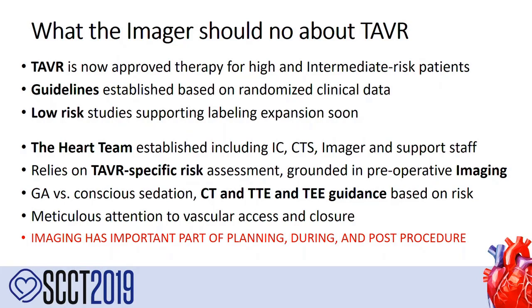So TAVR is now approved therapy for high and intermediate risk patients. It is in the guidelines and has been established based on randomized clinical data, and low-risk studies supporting labeling expansion, and that's probably going to come soon, I believe, in the fall. What TAVR did is really establish the heart team, which includes interventional cardiologists, cardiac thoracic surgeons, imagers, and support staff. And it relies on TAVR-specific risk assessment, which is grounded in preoperative imaging.